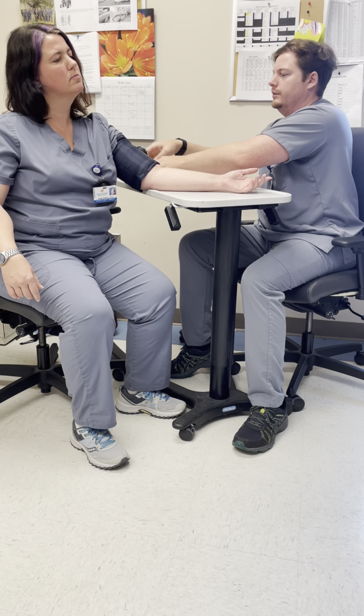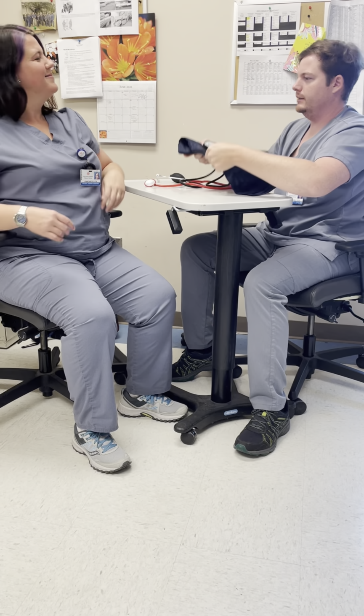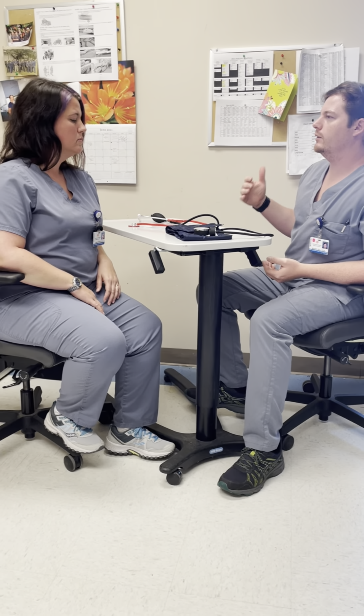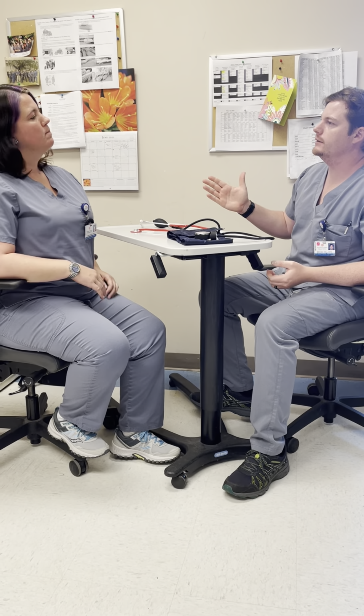All right, so blood pressure was a little bit elevated. The occlusion point was 130, and so what we do is we go 20 to 30 millimeters of mercury above that. So we were starting at 150, and then I started coming down, and maybe I got you excited, but it was 135 over 80. So the normal range is 120 over 80, so it's considered high.